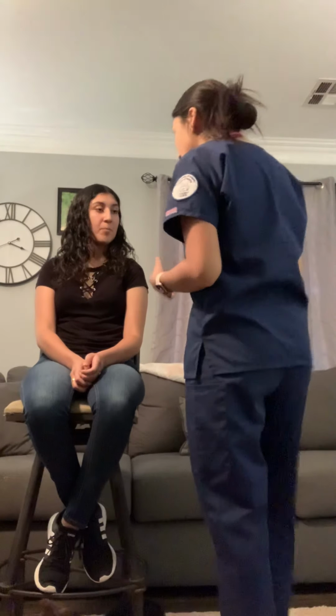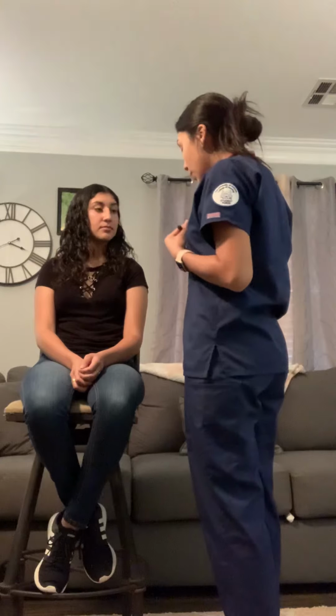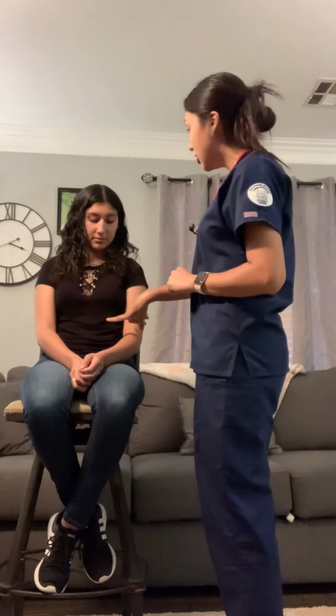Again, if Amber's pulse rate was different, I would listen for 60 seconds, but since it was normal, I only listened for 30. And Amber, to auscultate your pulse, I would use my stethoscope at your apical pulse, which is right here where your mitral valve is. We would do that for a full minute.